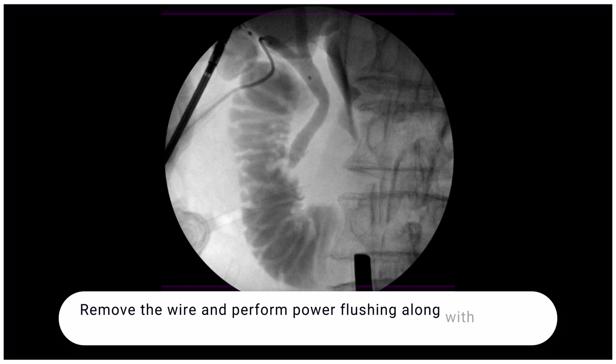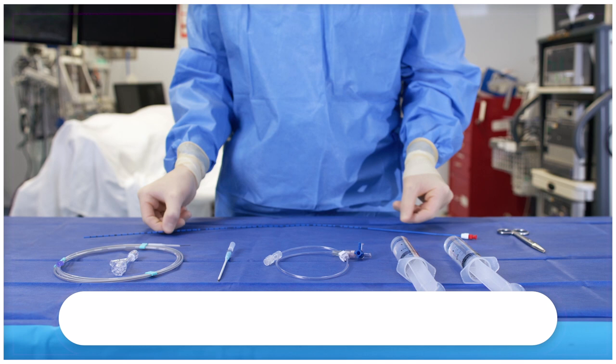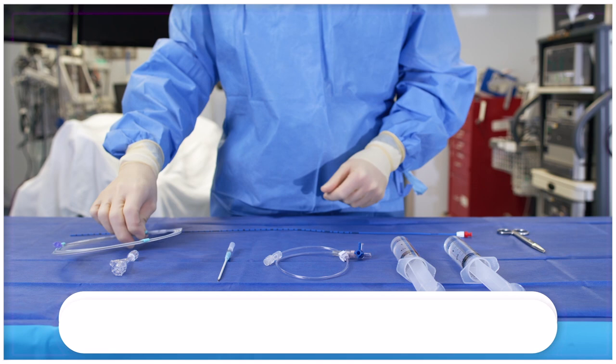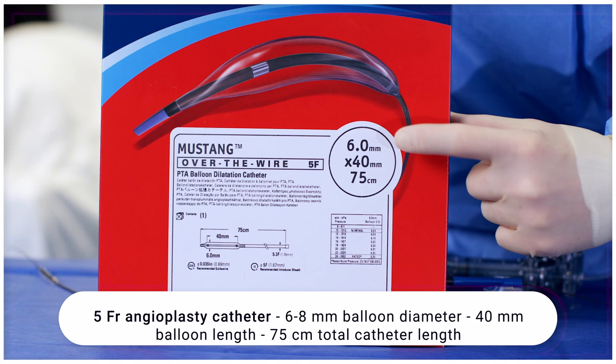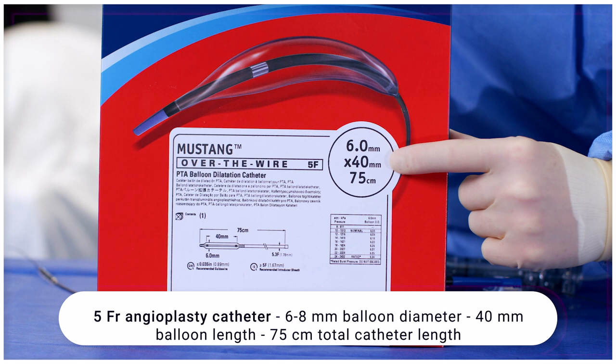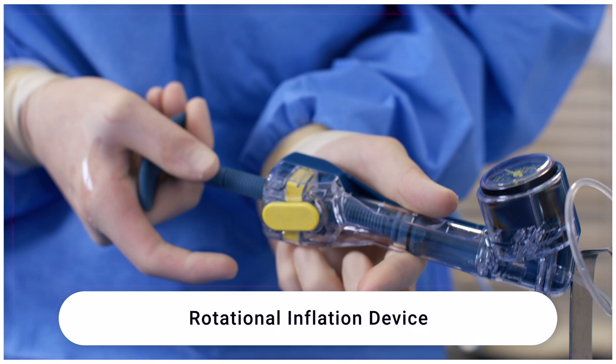Supplies needed for balloon sphincteroplasty: a 12-gauge angiocatheter, a 6-French ureteral stent, a 0.035 floppy tip guide wire, a 5-French angioplasty catheter with a balloon diameter of 6 to 8 millimeters, balloon length of 40 millimeters, and total catheter length of 75 centimeters, a rotational inflation device, and a three-way stopcock with extension tubing.